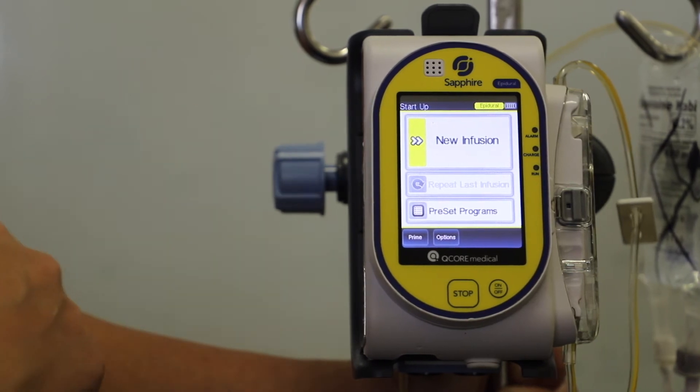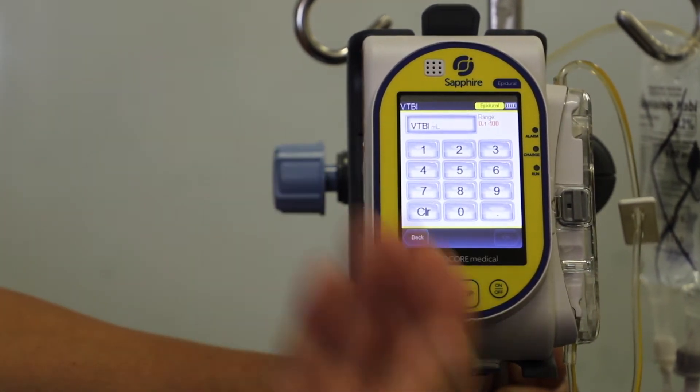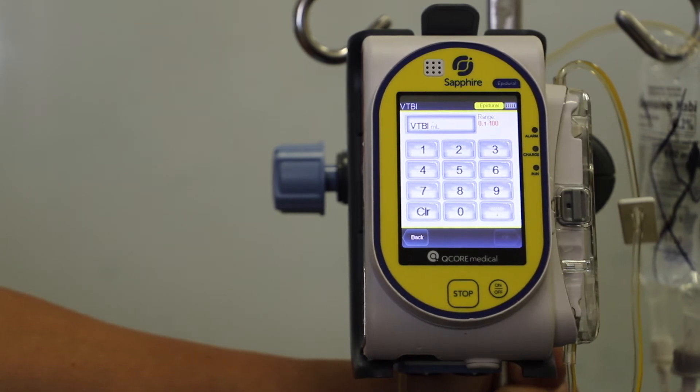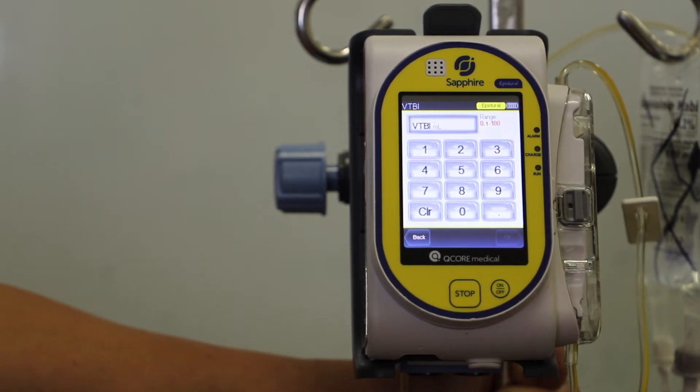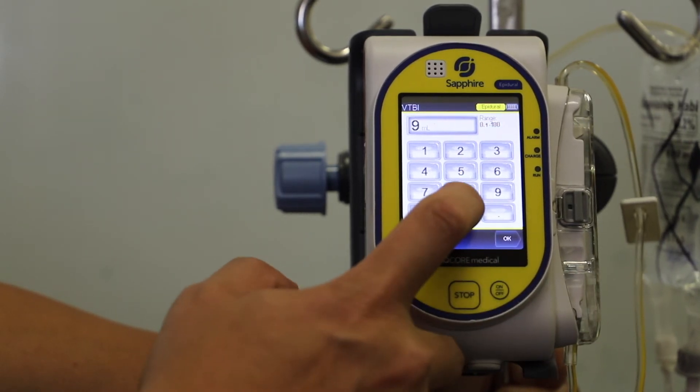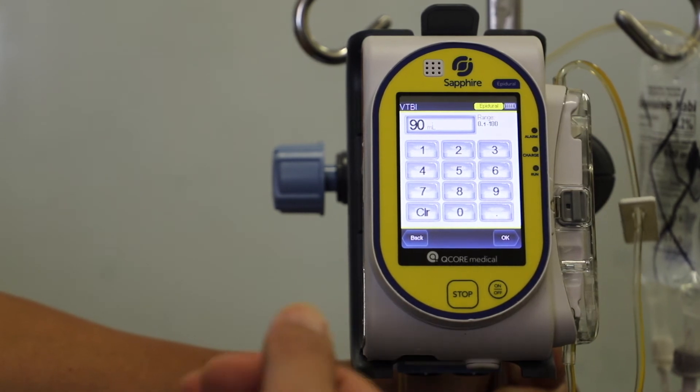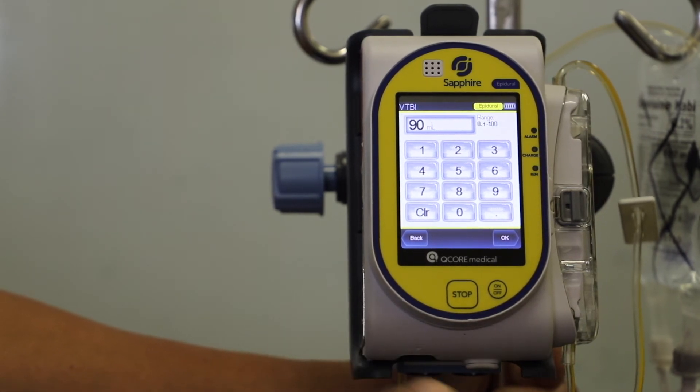We go to new infusion, a volume to be infused. So if you have a bag that has been primed, you would select 90. Otherwise, if it's an additional bag, you would choose 100.